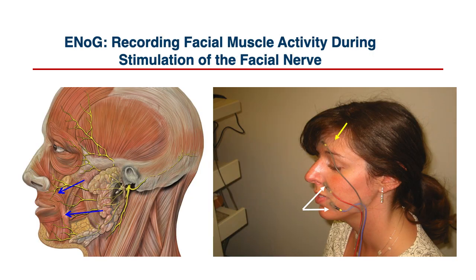So here's the nasolabial fold, corner of the nose down to the mouth. And there's a lot of muscles there. If you look at the little diagram on the left, there's just nothing but muscles. We're always using our mouth. I'm using my mouth to talk, you use your mouth to chew. So those muscles are very strong. So we want to get the recording electrodes on top of these very, very powerful muscles around the mouth. One up by the nose and one at the corner of the mouth.